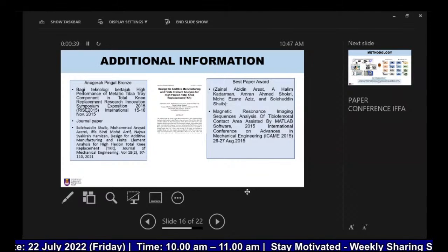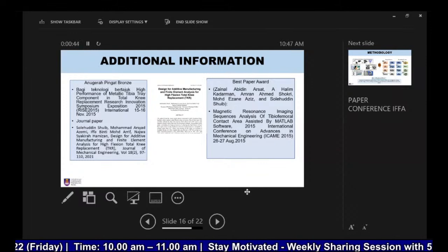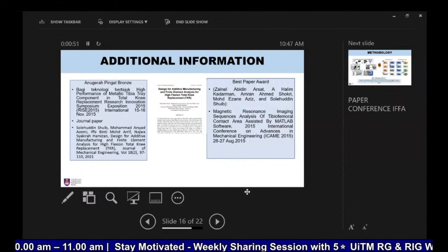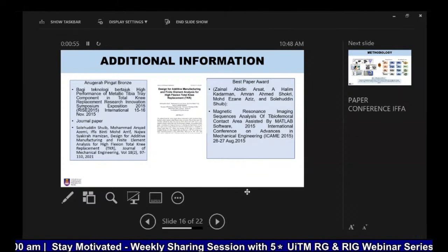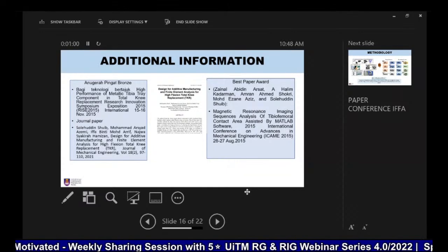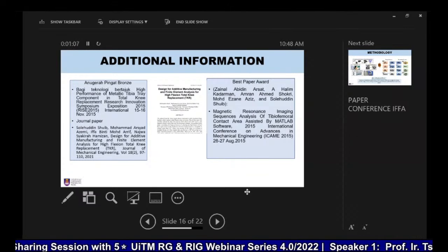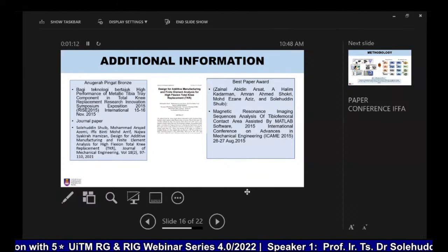So at the end of the day we have our own high precision implant or any implant. Whichever researcher wants to do it later on, the flow will be the same. We start with what we call the digital workflow, and then you need to study the design of it. You do the design, reverse engineering, then you do analysis, and then you produce, you do testing. And you must engage with the medical team.